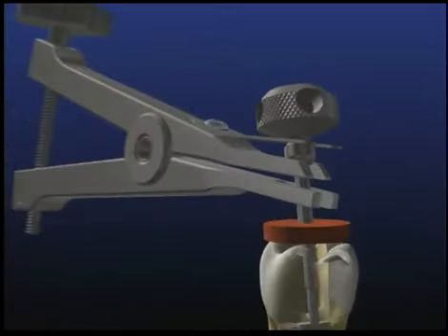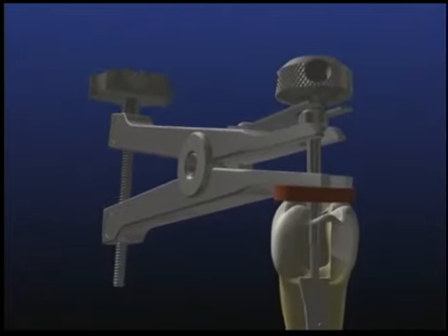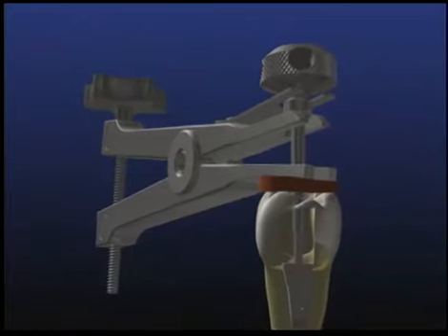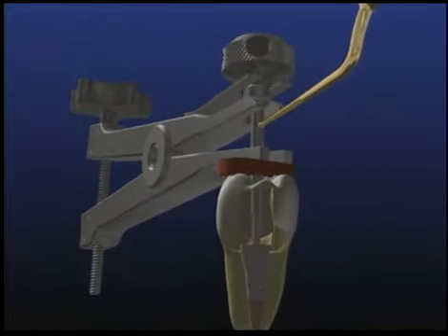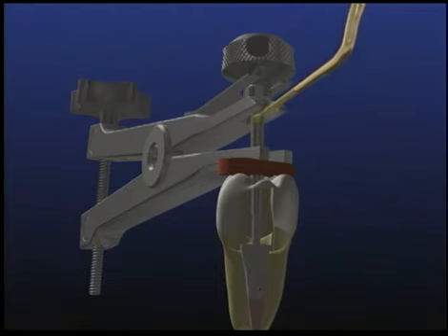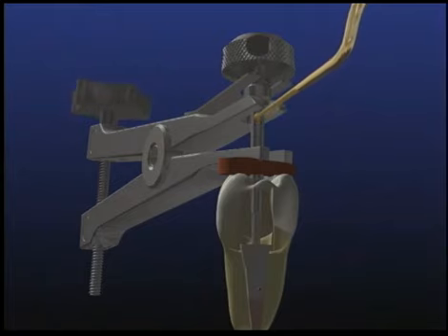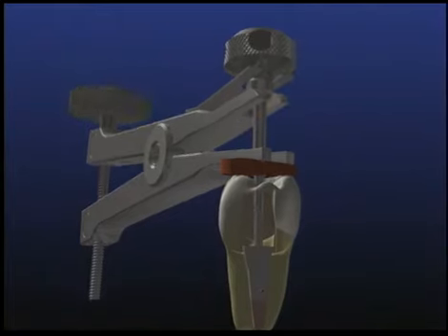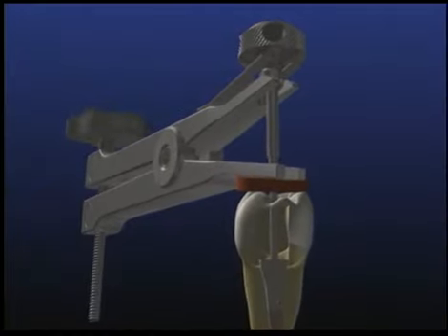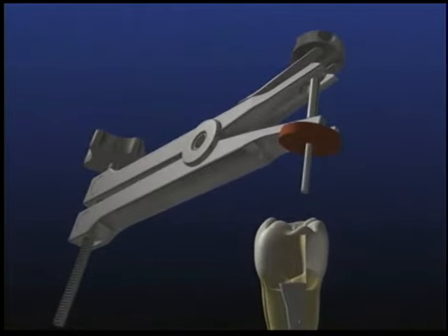The screw knob is slowly turned and the jaws begin to open. Make certain the compressing cushion is properly protecting the tooth as the building removal loads begin to elevate the post. If the screw knob becomes difficult to turn, place and activate a Pro Ultra Endo 1 ultrasonic instrument directly on the post-engaged tap. Ultrasonic waves of energy transmitted to the post will allow the screw knob to turn with greater ease, which in turn progressively separates the jaws of the extracting plier. This action promotes the safe and controlled liberation of the post. Ultimately, the PRS provides clinicians an important post-removal method that is employed when ultrasonic techniques are unsuccessful.